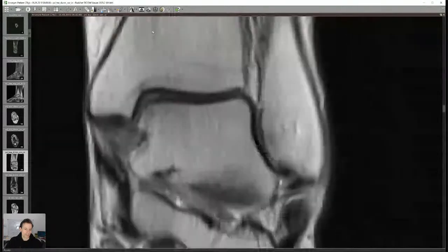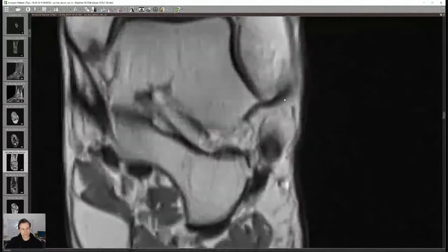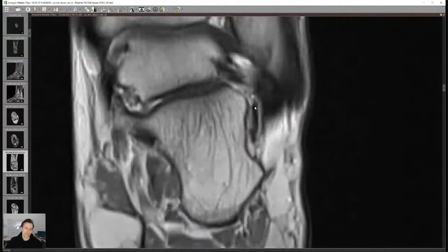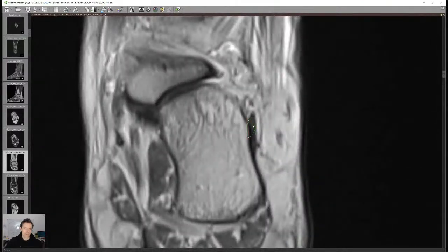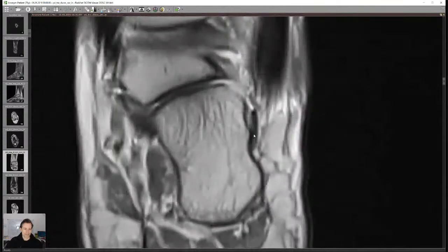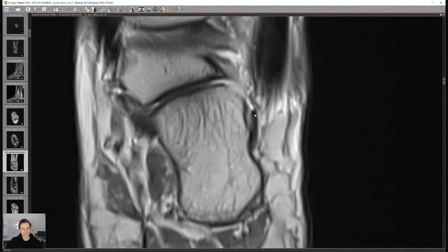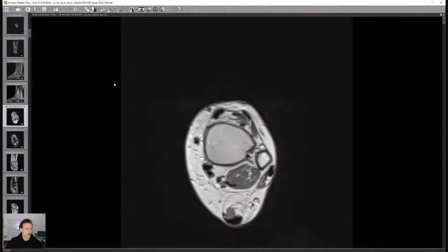The best way to identify the LFC — the ligamentum fibulocalcaneare — is to go from the tip of the fibula. It makes this shape going down; here are the peroneal tendons, and the ligament is this black structure between the peroneal tendons and the calcaneus, inserting onto the lateral calcaneal aspect. You should see a black ligament in most patients here, unless it's edematous or torn — which is not the case in this patient.